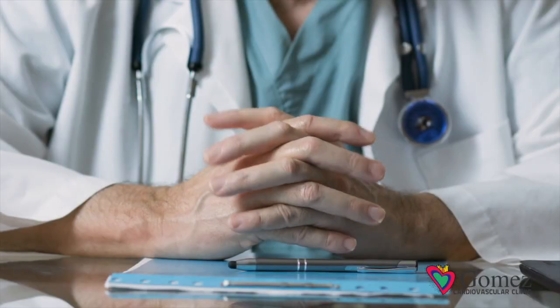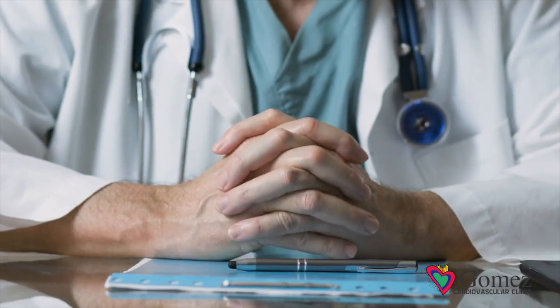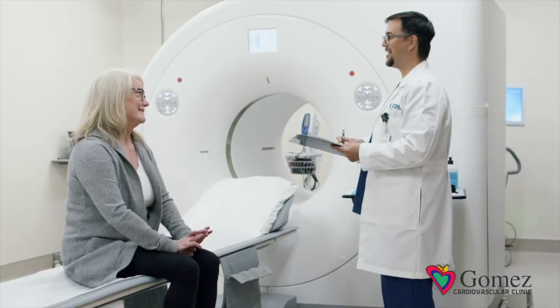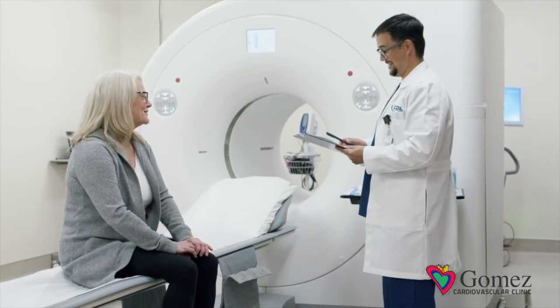Your doctor has ordered a highly advanced cardiac PET-CT study to look at the blood flow to your heart. In this video, we wanted to show you some of the things you can expect during your exam.